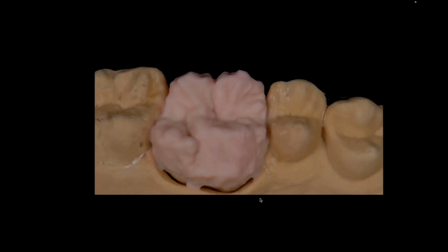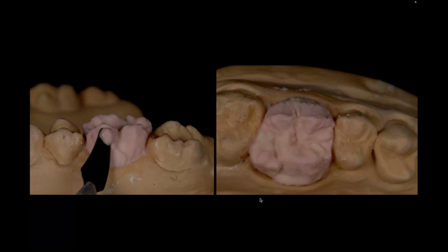And usually when I would build during these courses, I would build full contour, and the goal was to make the person build everything up in one or two powders and get the real shapes and forms and all the things that were important, and then come back and do a little bit of a cut back to understand where the enamels went. And it was very similar to what I did in an anterior restoration. It was just a concept to build full, learn to cut back, and then relayer the secondary components.